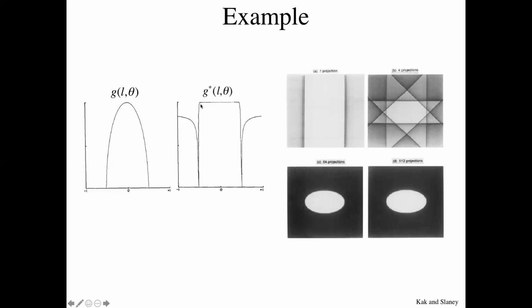And happily, it has a flat top, which our circular object probably has, and it has these very deep negative lobes that will take away signal that's on the outside after this back projection. And then as I add more of these at better and better angles, I get a higher resolution estimate of my object.